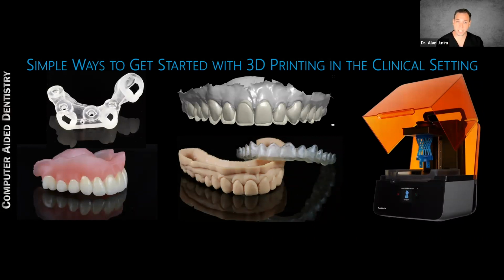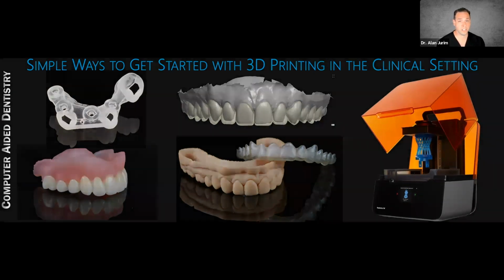And the design can be kept, and it can always be printed, replicated over and over if necessary.